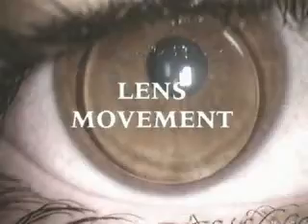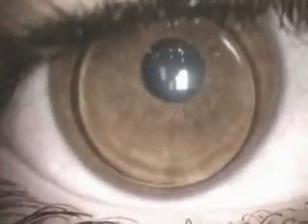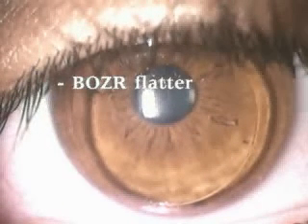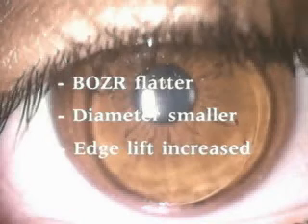Lens movement. A key factor in successful RGP fitting for keratoconus is the quality of lens movement. With each blink, the lens should move freely across the cornea and then return to its position of rest. Limited movement may result in peripheral corneal desiccation, a build-up of post-lens debris, and possible lens adherence. To improve lens movement, the radius can be flattened, the total diameter made smaller, and the edge lift can be increased.